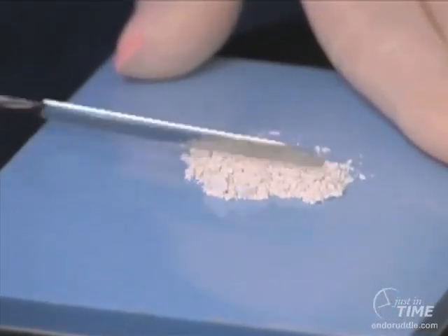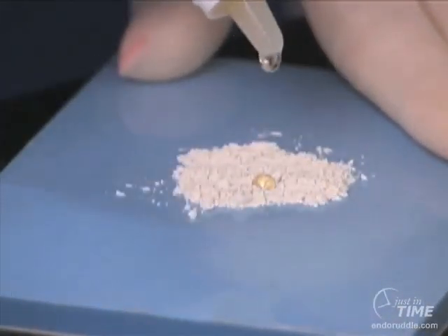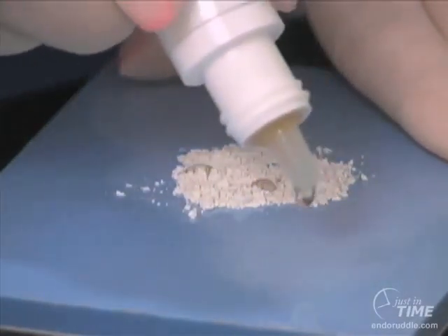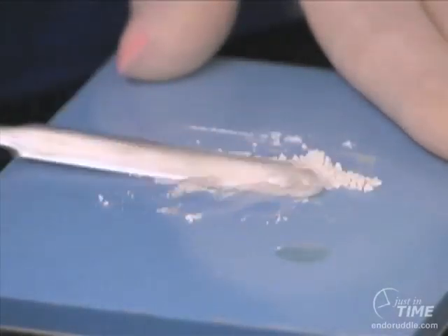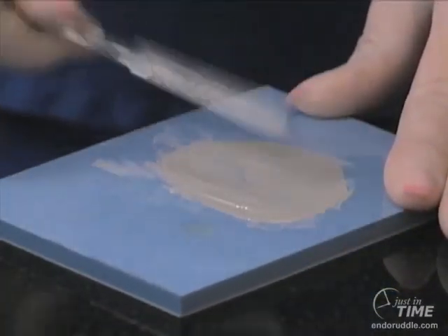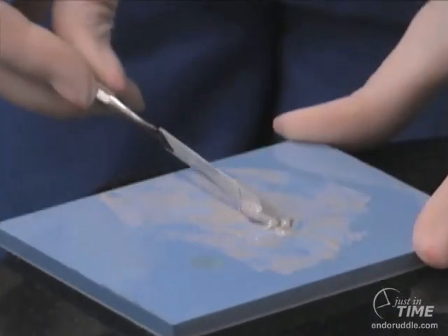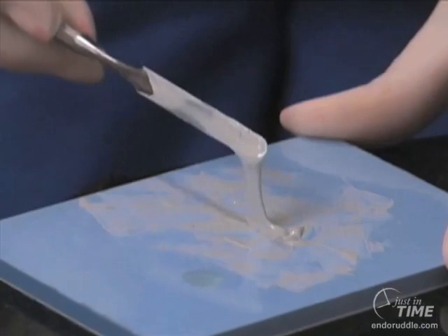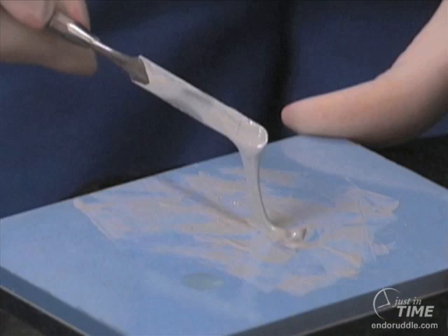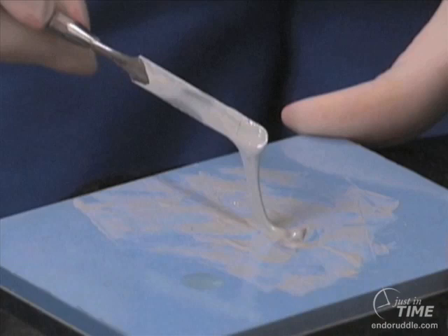Manufacturer's directions are to mix one drop to one shovel of powder — so for three shovels of powder we use three drops, perhaps with one extra drop on the side in case we need it. Train your auxiliaries to really crush down this sealer on the mixing pad, fan it out over a thin microfilm over a large surface area, and incorporate all the powder into the liquid. When you pull up the sealer it should not be too runny — we do not want the sealer to run back to the pad, as that would suggest we need more powder to achieve a nice viscous body that restricts surplus after filling.